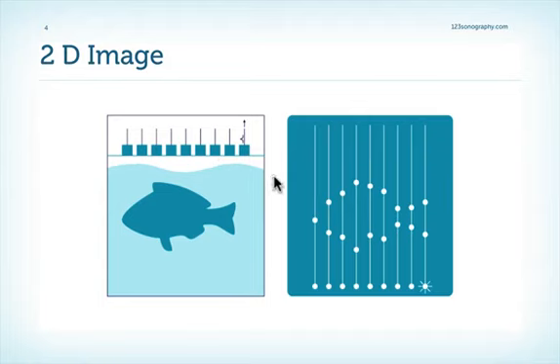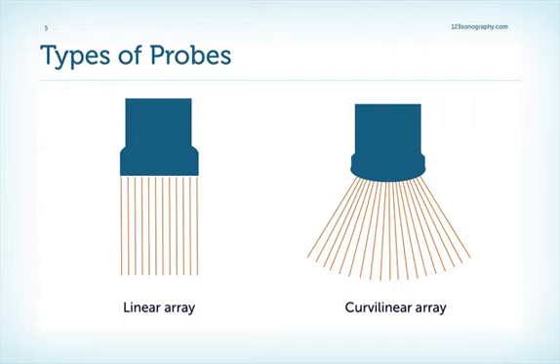Now, in the normal image, you will not notice that. It just goes so quickly that you have an entire picture in an instant. But on each boundary, we'll then get a reflection, and that is processed to an entire image.